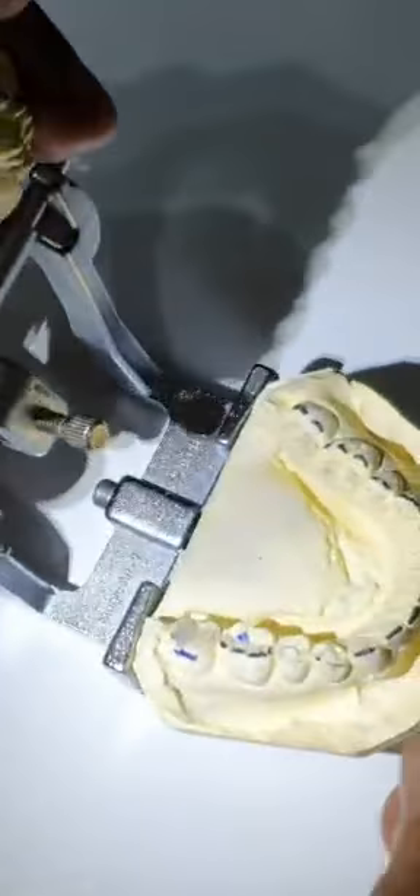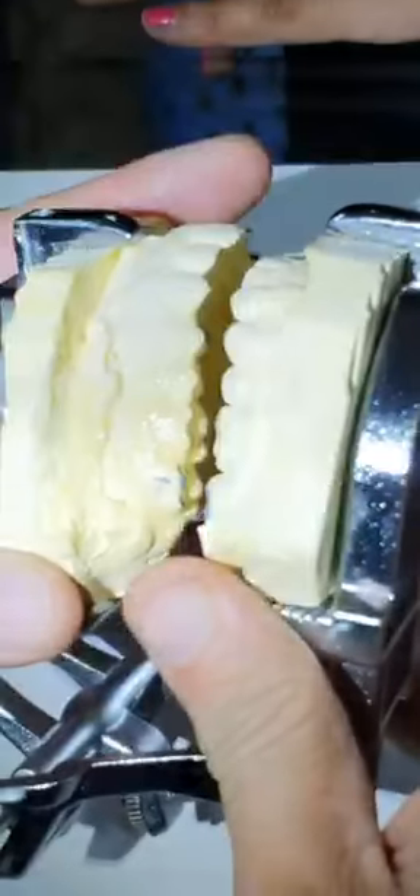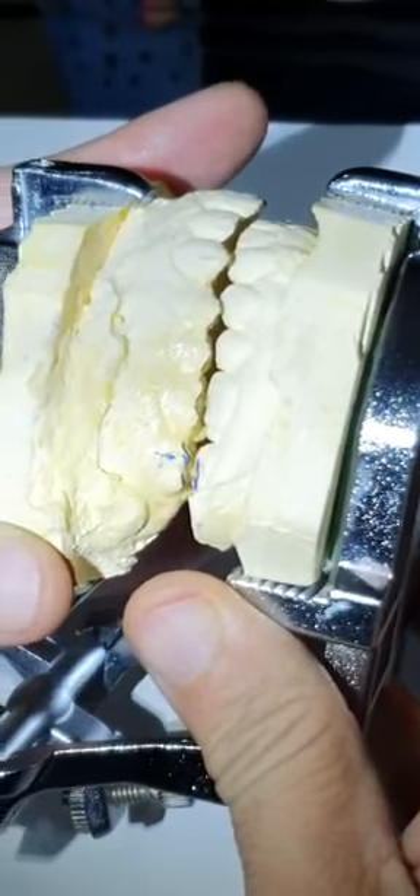Now I would do a block of all of these teeth: first premolar, second premolar, first molar, and the mesial of the second molar. I would etch them, dry them, apply spot adhesive, and now I would apply composite to all of these teeth. As we did only the mesial of the second molar earlier, I would take the patient into occlusion and cure it.